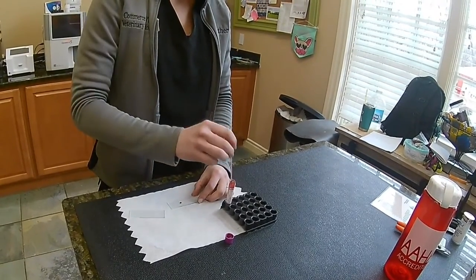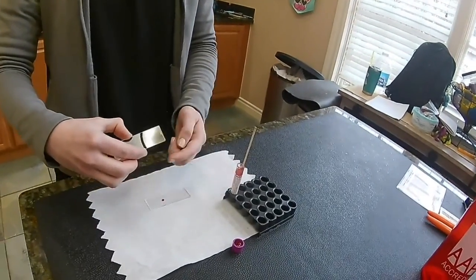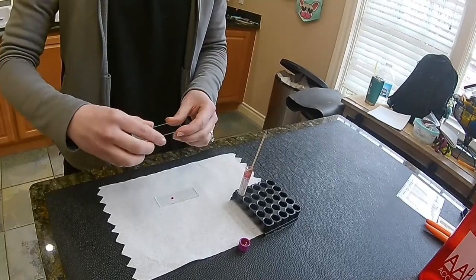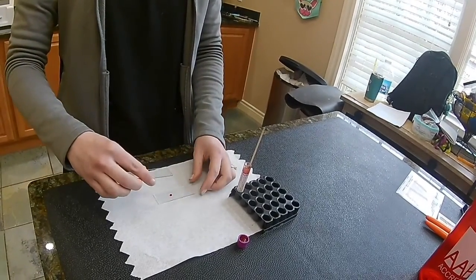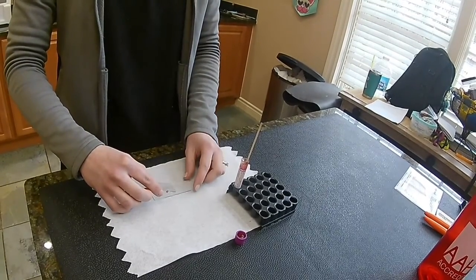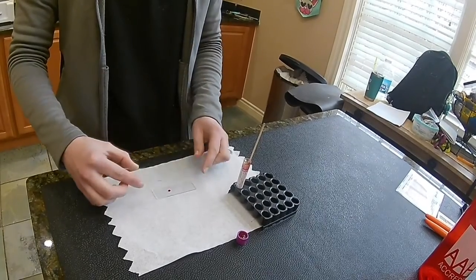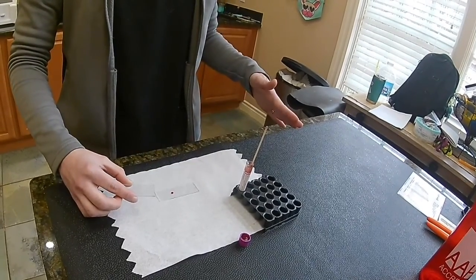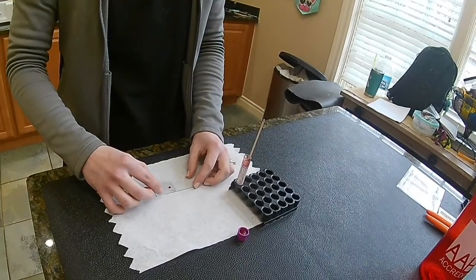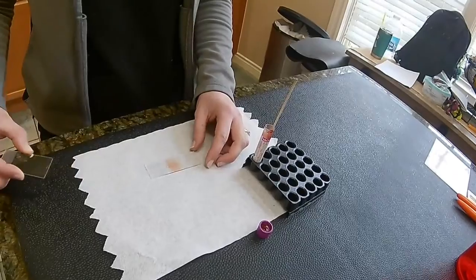Alright, so then I'm going to be holding this slide at the top and bottom with my fingers, applying even pressure at about a 30-degree angle, and I'm going to come back at my blood droplet, and then I'm going to let it pool along this edge, and then I will be quickly and evenly pushing forward. So I'm going to come back, letting that pool, and pushing forward.